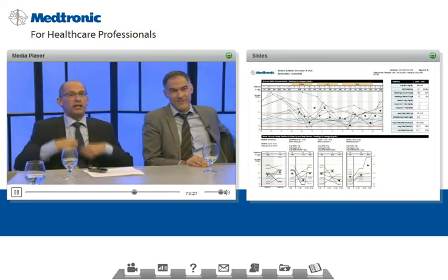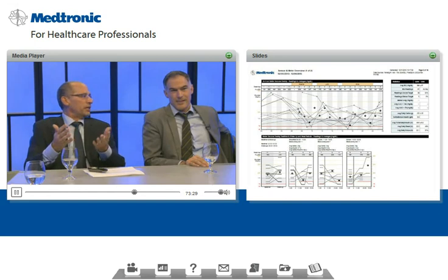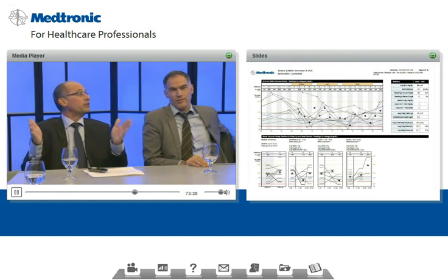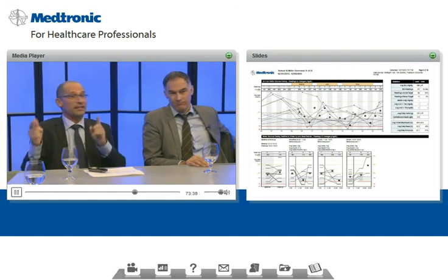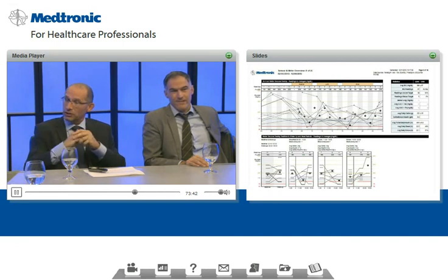Okay, you don't have to anger him by saying you have to measure more because he's measuring correctly. So in this case, you don't have the answer if it's insulin omission or bad plan. And I think that the audience were totally correct. So what did we do?